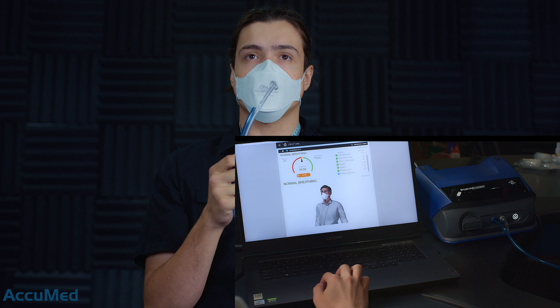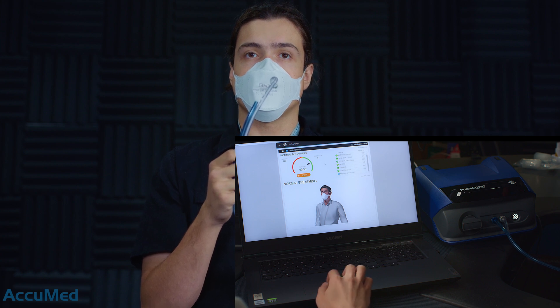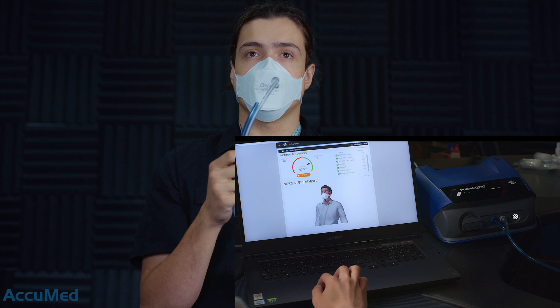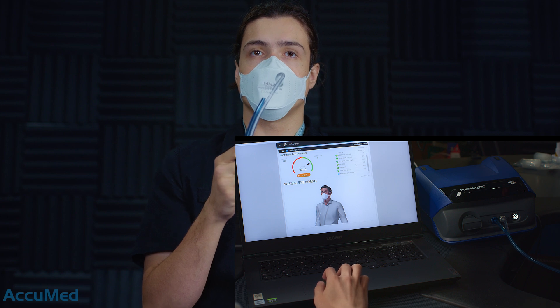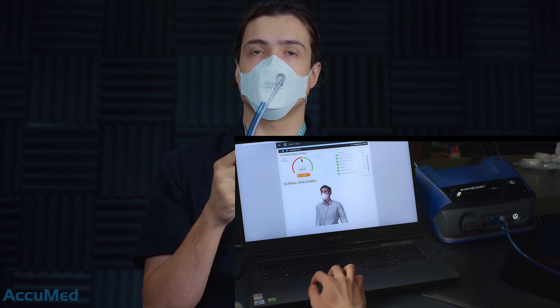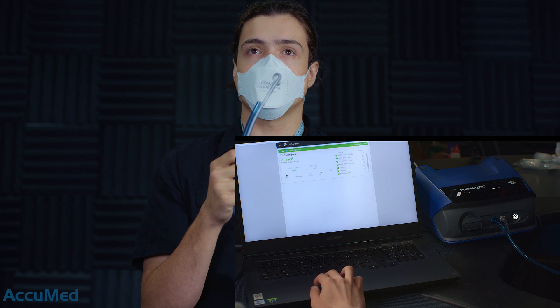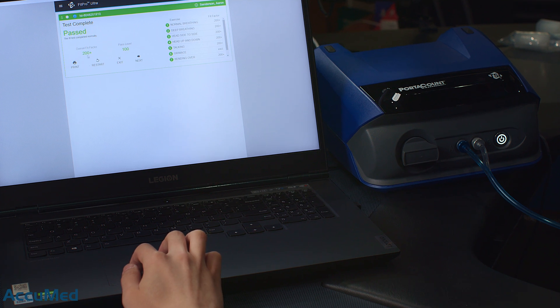The normal breathing is the last exercise that we are going to do. So far the fit factor for each of the exercises is 200 and above — 200 plus for all of them. The indicator is again in the green section, so for the last exercise we are expecting really good results again, most probably 200 plus. All right, the overall test result is a pass and the overall fit factor for this test is 200 plus.